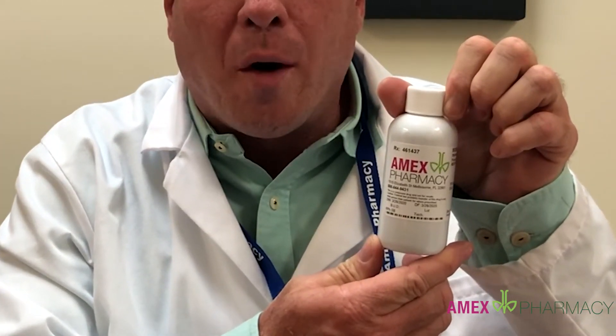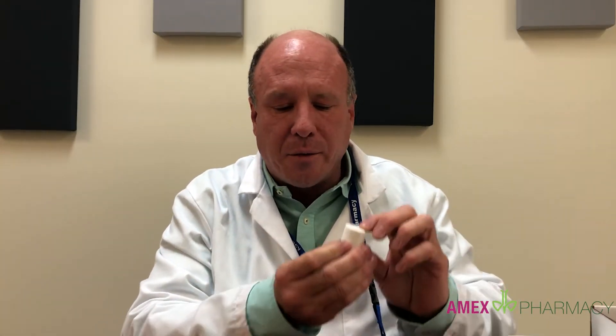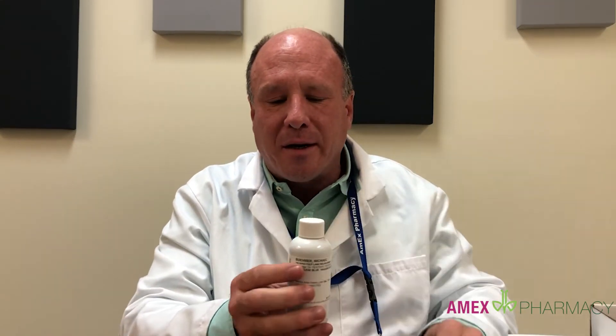Essentially you'll get a bottle of methylene blue one milligram per mil solution. That is your photosensitizer that you would use to coat the inside of the mouth with. I have drawn some up in a syringe so it's ready to go. You can also use the little flip top attachment for the top of the bottle that we send it in.